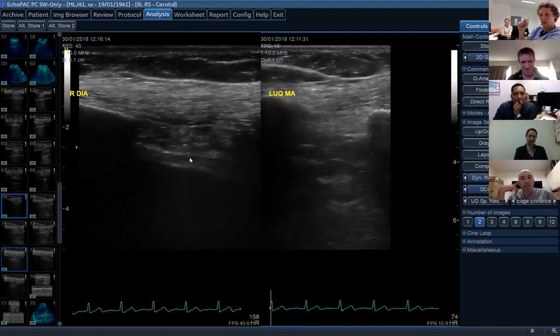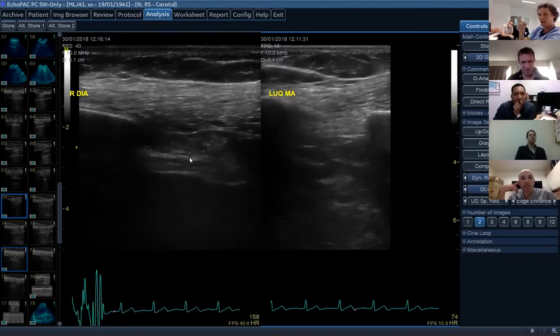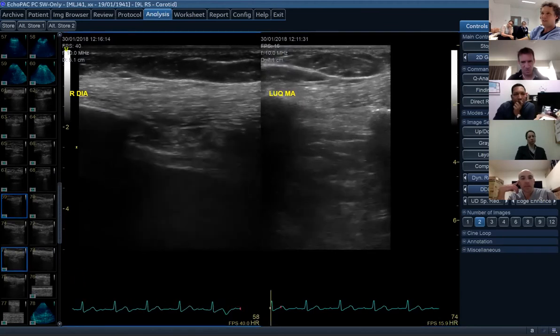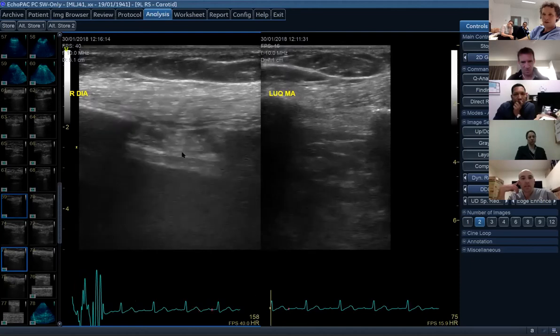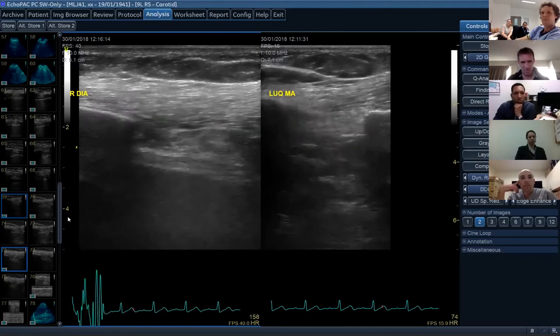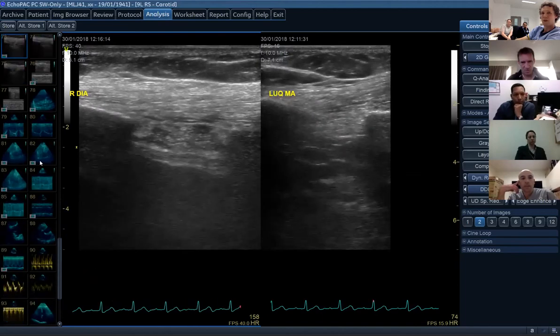So with the linear probe, you can look at the thickening of the diaphragm, and this guy had collapsed on the left side. That wasn't moving well. And I don't know how well it comes out, guys, but you get the idea of the diaphragm. There we go. So I'm just trying to compare those two bits that are moving versus those two bits that are moving. Okay. That's the first way of doing it. And the second way is by this.